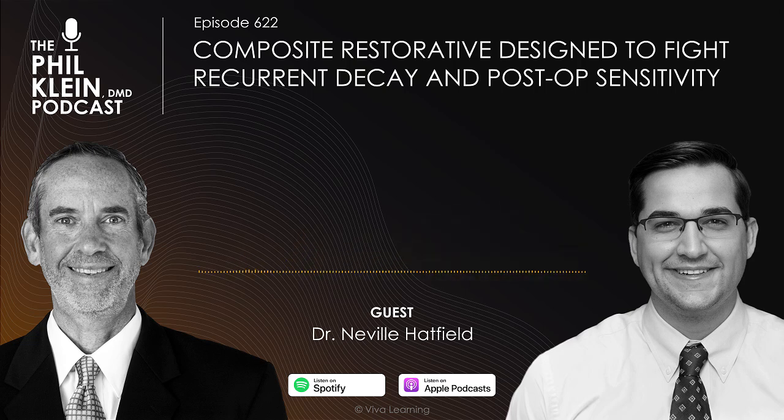Now, when we're talking about other forms of sensitivity, a lot of them can be iatrogenic, right? We don't use the proper technique, we rush things, we don't do the proper length of time, and that can all kind of lead to pulpal inflammation and then obviously postoperative sensitivity. So I think it's really important to obviously follow the IFUs, the instructions for use, of a lot of our materials, but also just understand that sometimes it's not great to rush that extra 5-10 seconds, and really count down the time that we need to properly go through our steps.